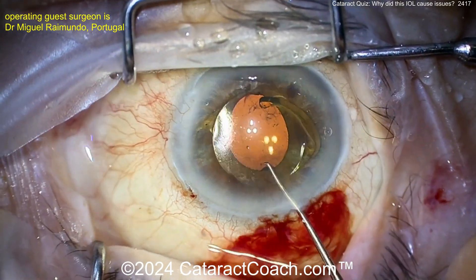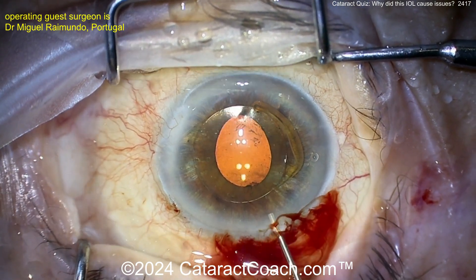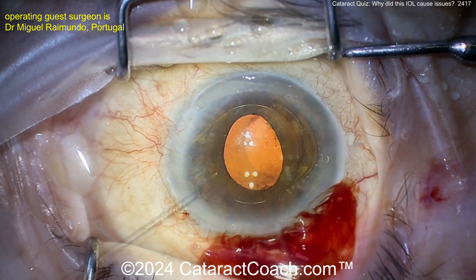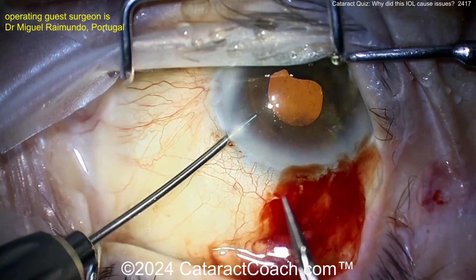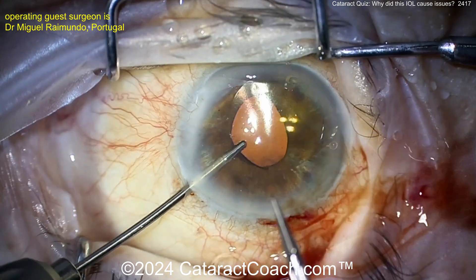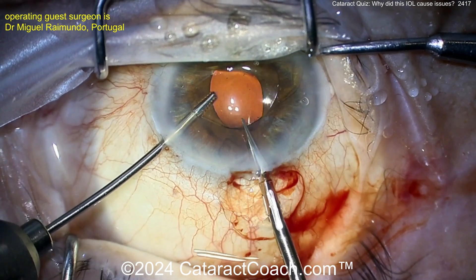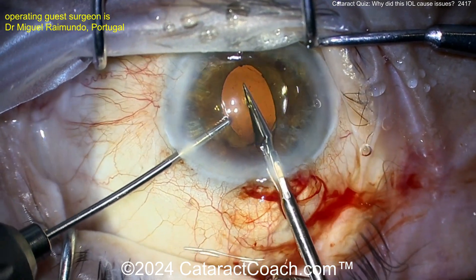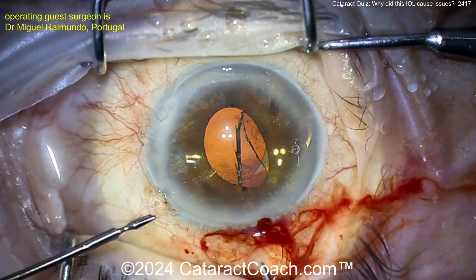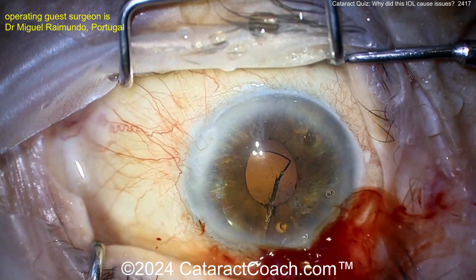The whole IOL is now on top of the iris and a large incision has been made. More viscoelastic is going in to protect the endothelium, going above the optic. Now what are we going to do — twisting it out? There comes a forceps to grab it. Okay, that looks like a scissors in the right hand — so the lens is going to be cut. You could do the twisting-out technique we showed here on cataractcoach.com; it makes it much easier. The lens is now bisected and being removed from the eye — there's one half, and here comes the other half.